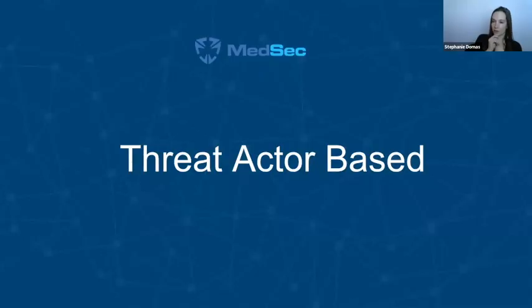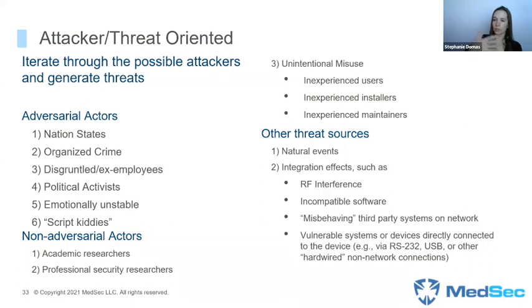Threat actor is the other type of threat modeling that I spoke about. And so threat actor is all about starting with who are your threat sources, right? Who are the people who are even bringing threats to your device?